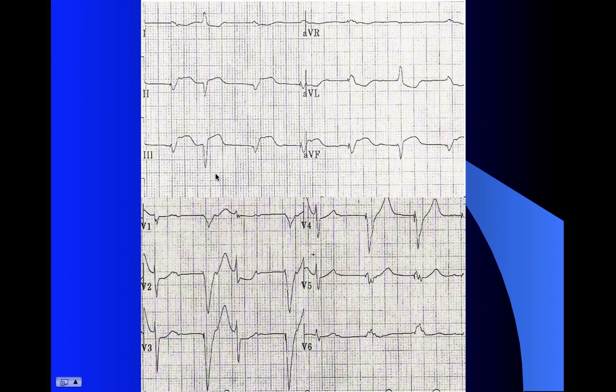Same concepts here. Look at your inferior leads. Look how much elevation we have. A good few millimeters. That's way too much compared to the depth of the S wave here. Similar in lead 2, in lead AVF. Now look at AVL. That's probably too much depression for the size of that R wave.